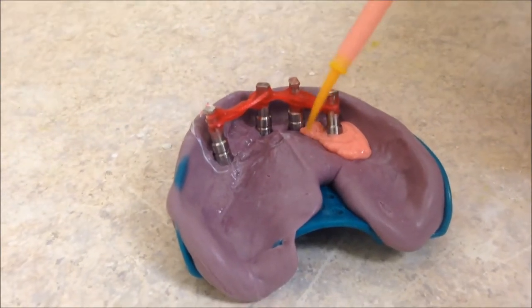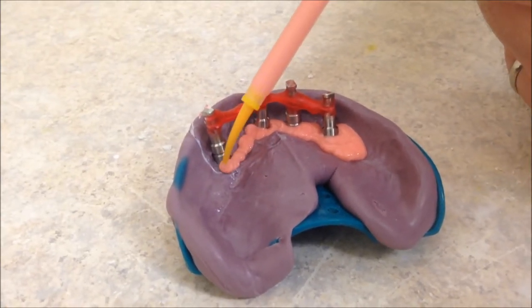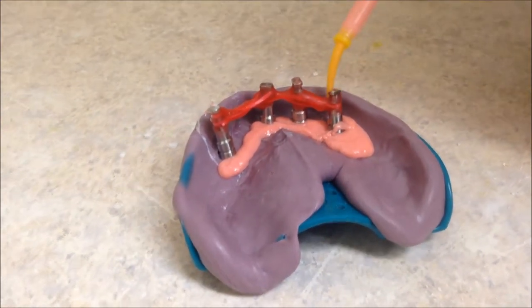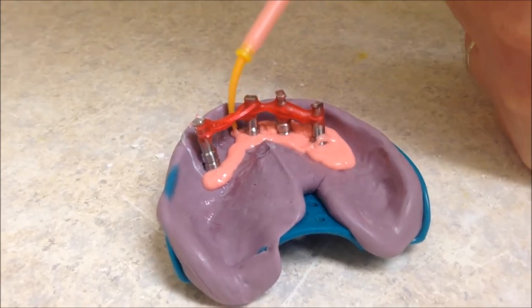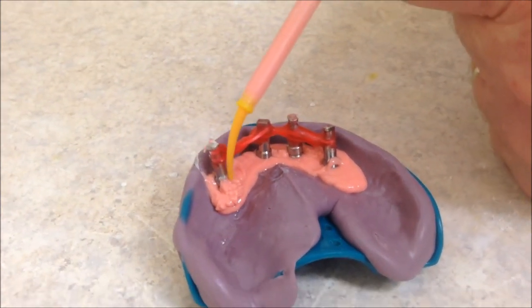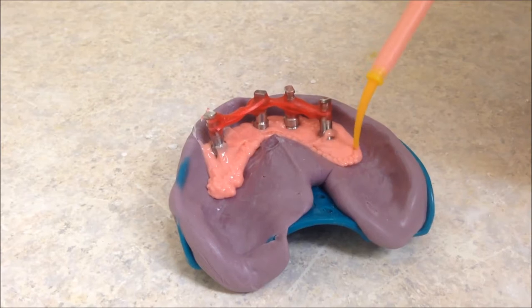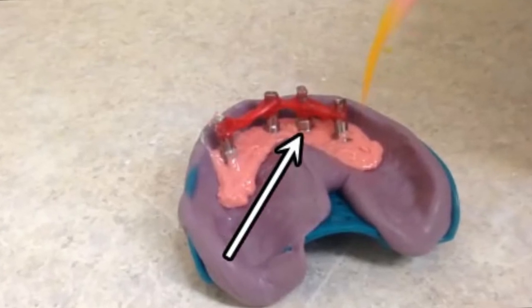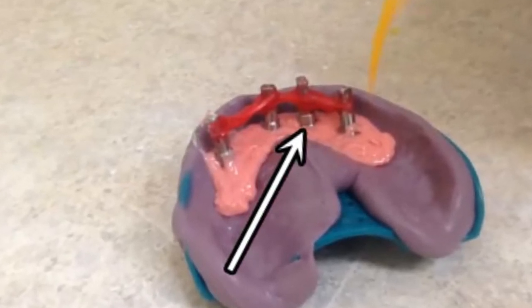After the material has set, simply pour using the low-expansion stone of your choice. Make sure to visually inspect the gingival mask quickly after completion to make sure that all interfaces have been covered. If noticed in a sufficient amount of time, this can be added to without any negative effects.